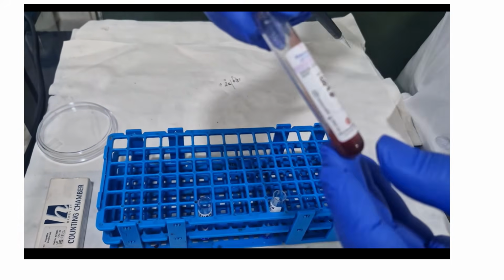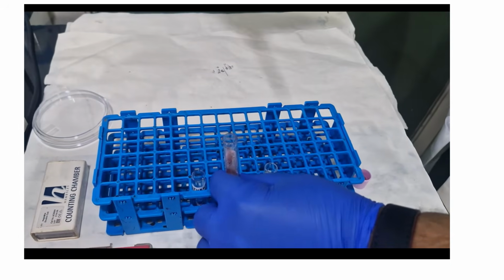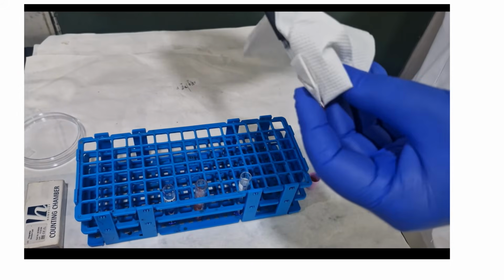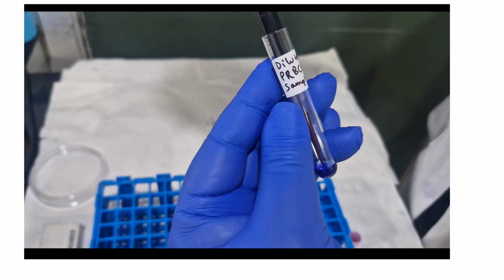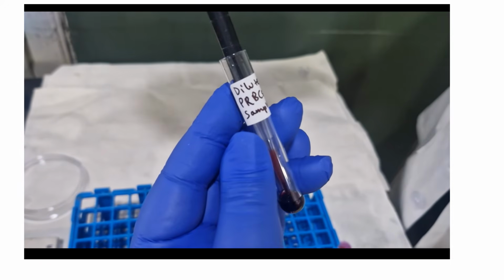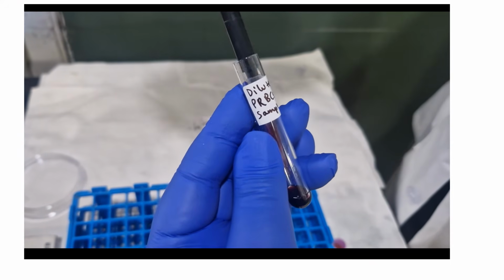Next, we will pipette 80 microliters of the sample into the tube containing 320 microliters of the Turk's fluid. Rinse the pipette several times to mix the two fluids until the pipette tip is no longer coated with intact red cells.